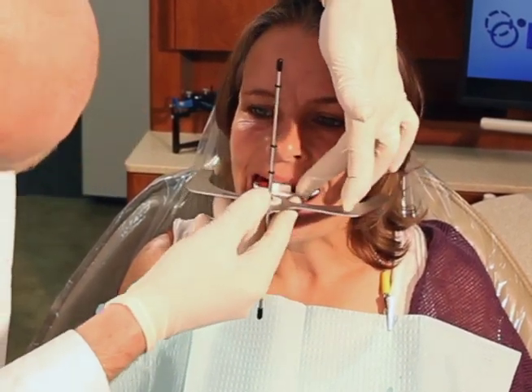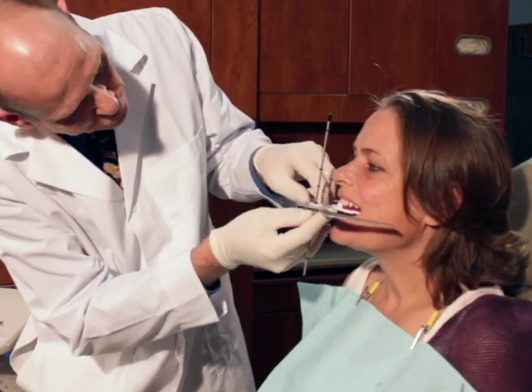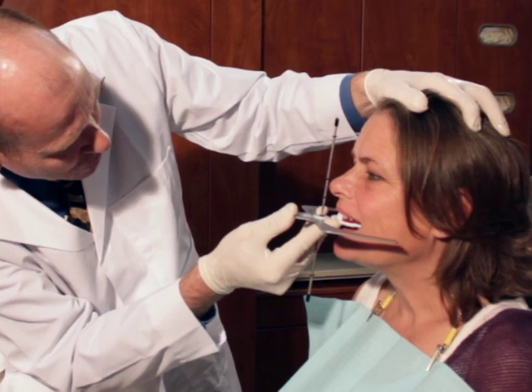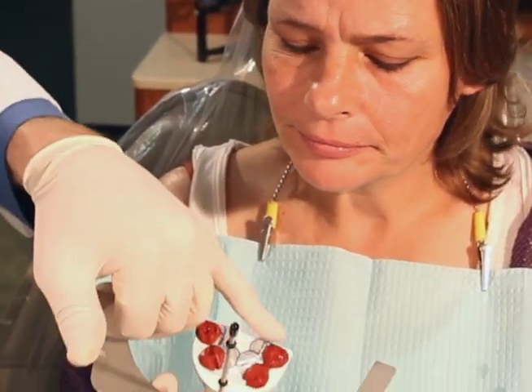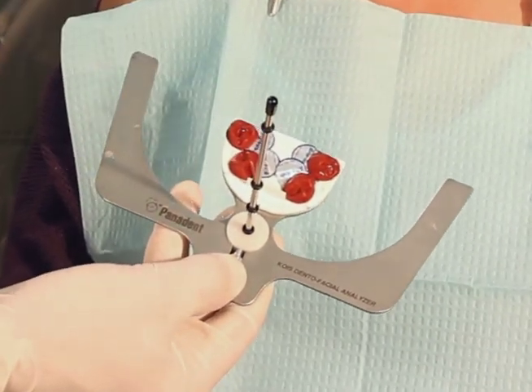Open the patient's mouth. We're going to set the incisal edge to the wall on the index tray, then push the vertical rod back and align it to the patient's facial midline, coming straight up to whatever tooth hits first. When it stops, take it out — you can see that we now have indentations of the teeth into the compound. We're going to harden this compound in cold water.